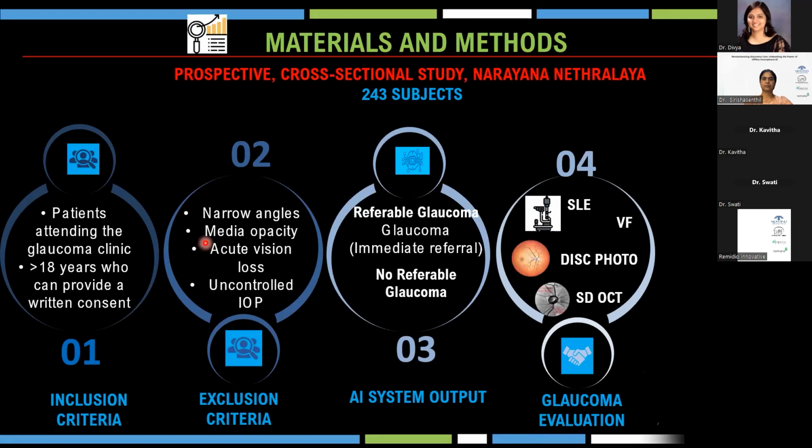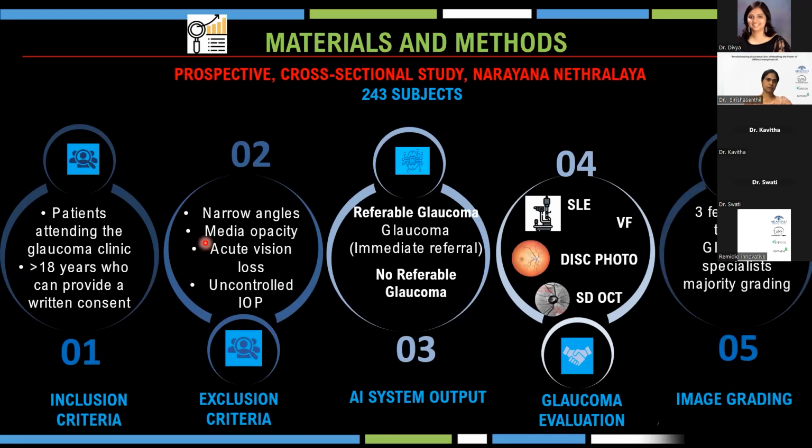All patients underwent a detailed glaucoma evaluation, which included a slit lamp evaluation, IOP, GAT, gonio, visual fields, disc photo, and an SDOCT. And image grading was done by three fellowship trained doctors. What we did was we studied how the AI output compared against just the image grading by the clinician, and against the end of a comprehensive clinical evaluation that included visual fields, disc photo, and SDOCT.